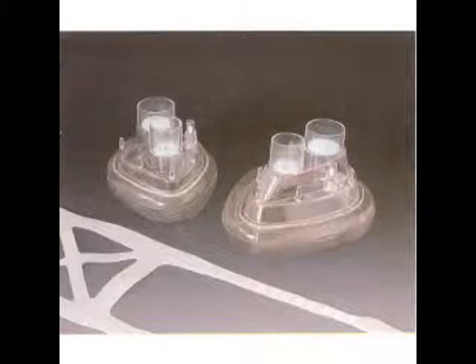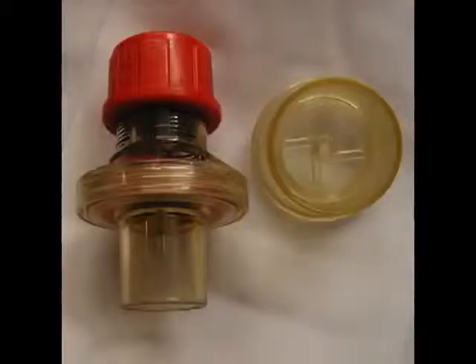Years ago, positive pressure was applied with a system like this. You see, this is a pressure mask that can fit over the patient's mouth and nose. There are two one-way valves on it. One of the one-way valves is an inlet. It allows a gas flow of greater than 30, 40 liters per minute, enough to meet the patient's inspiratory demand, but they couldn't exhale through it. They'd exhale through another one-way valve, which was then connected to a spring-loaded PEEP valve.